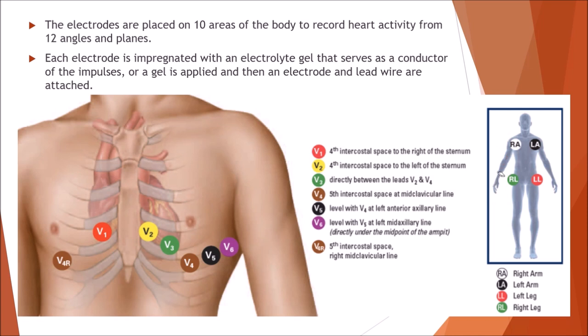I like to put them up on the chest, about the shoulder area. That's kind of my favorite section. So that's for the right arm and the left arm. For the right leg and the left leg, again, you can kind of place them anywhere along the leg. Some people like the thigh, leg, the actual foot.